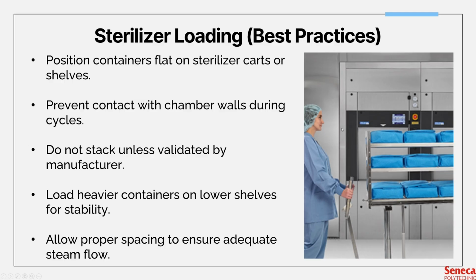It's a practice that is no longer being exercised because it just makes drying longer. We're just not 100% certain that the containers below the stacked containers, especially the one on the lowest level, can't guarantee that it's been sterilized completely and successfully.